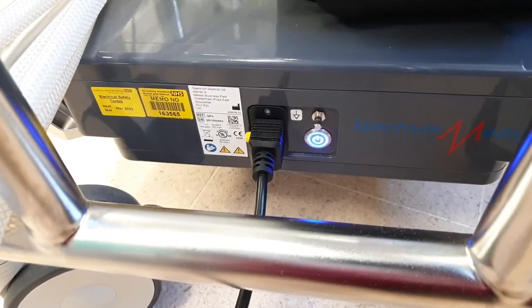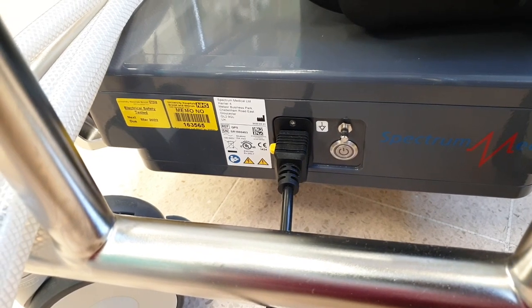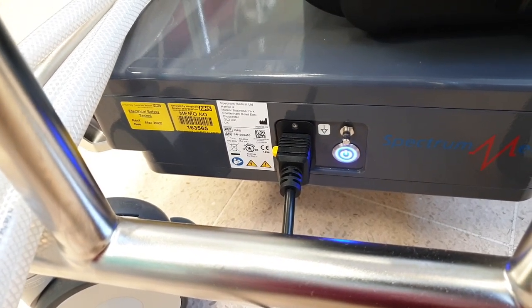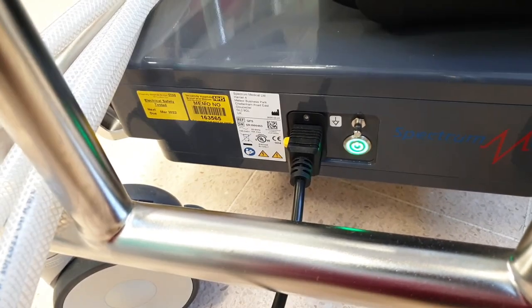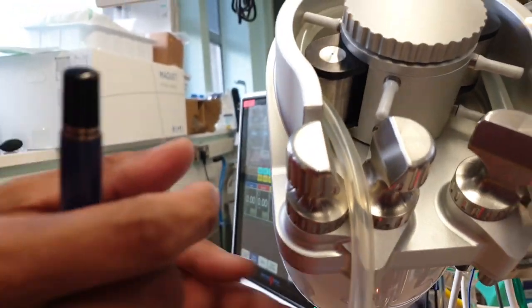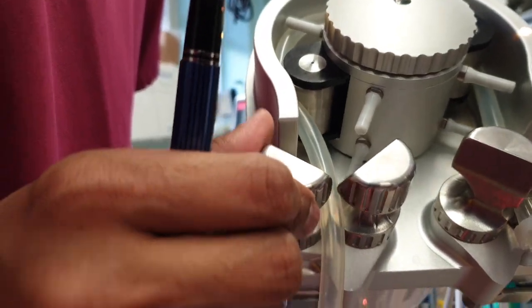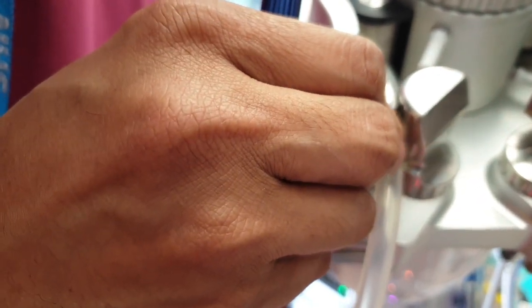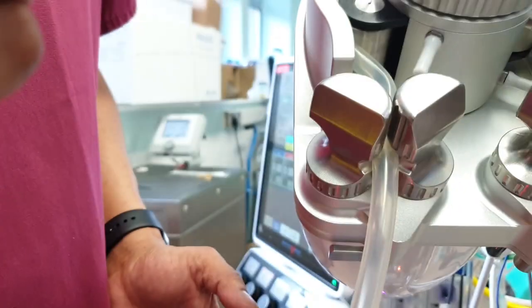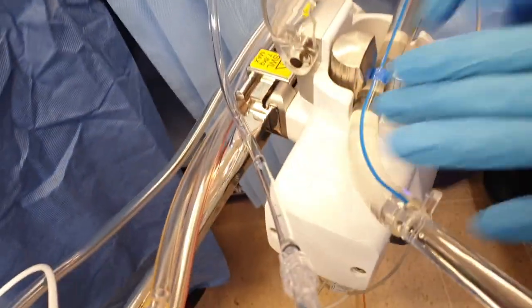Right. Here's some battery. Back on mains. And how do you lock it? Just lock it, and then turn it. You hear the clicking sound when you hit the maximum. That's it. You can try. You just put the tubing in, right? There, and then lock it.